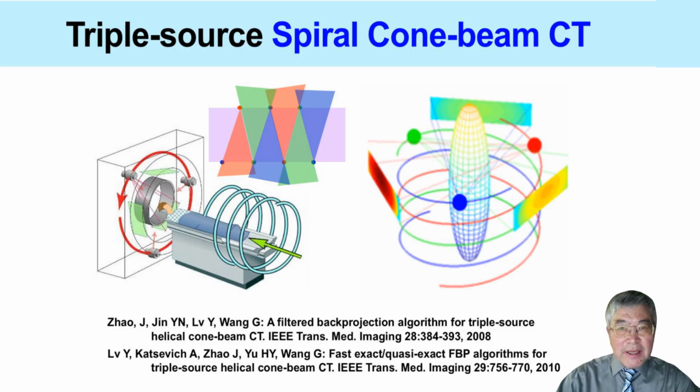These issues make the reconstruction problem mathematically challenging. At the same time, it is very important because cone beam spiral CT has many practical applications. It is central to modern medical CT, and it also appears in industrial imaging, security screening, micro-CT, and other areas.